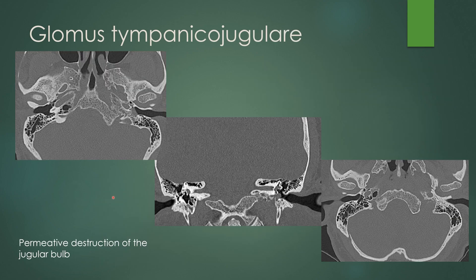You can have a glomus tympanicojugulare, which means it connects from the middle ear cavity down to the jugular bulb. You'll see what looks like glomus tympanicum with that soft tissue mass along the cochlear promontory, but then you see permeative bone destruction extending inferiorly to the level of the jugular bulb. You're losing that nice cortex around the jugular bulb — it has that moth-eaten appearance — with soft tissue extending down from the middle ear cavity and opacification of the air cells between the middle ear and the jugular bulb.